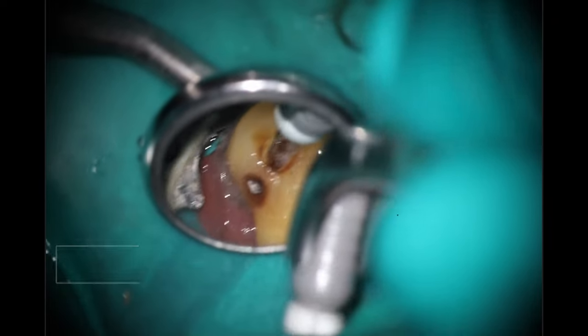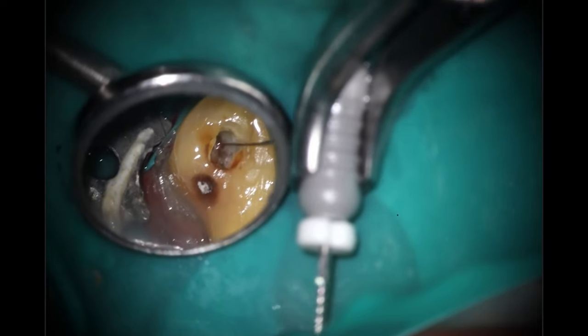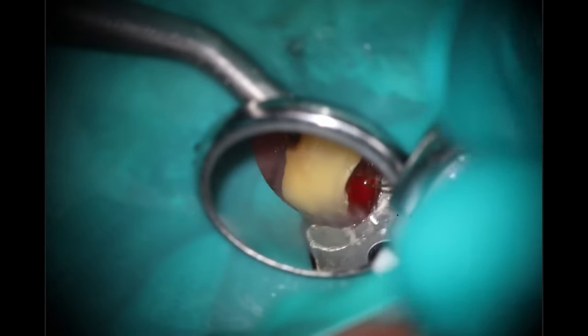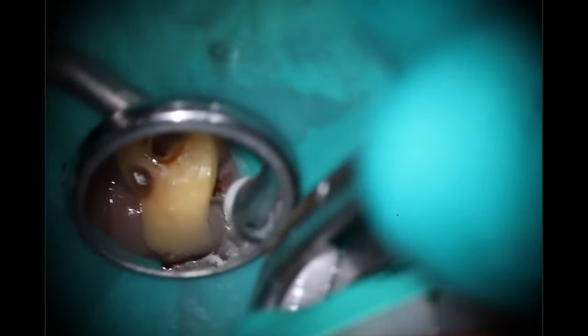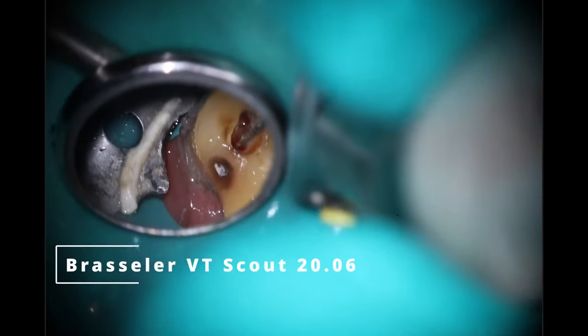So we're going to start off as we normally do — 8C file down to close to the estimated working length I got off the cone beam, getting inside there. And I'm already starting to feel some pretty decent resistance in the MB root. I'm trying to see if there's anything else, maybe an MB2, if I can get to the palatal through the more palatal aspect of the access here — not really. So we're just going to open up what I can with my 2006. I'm sorry this is covered a little bit more than normal. She couldn't open very far, so the access was a little bit difficult here.